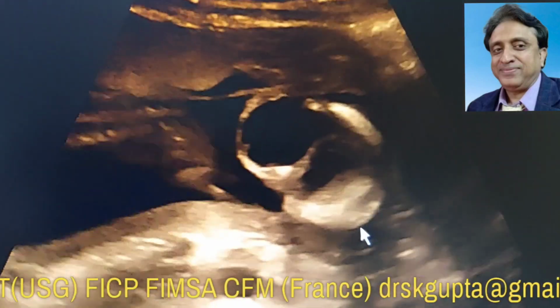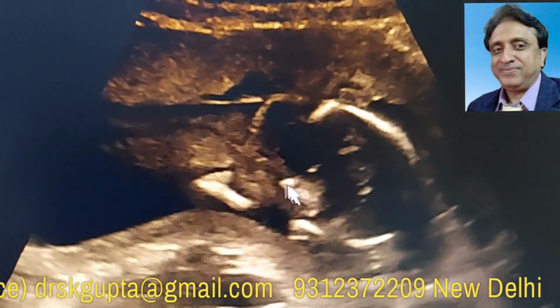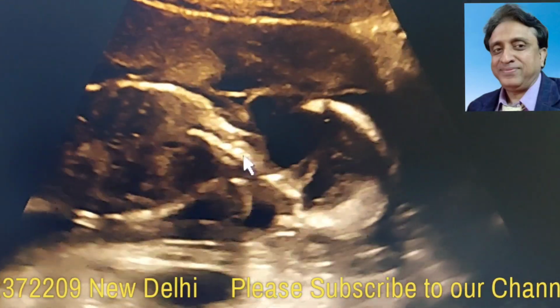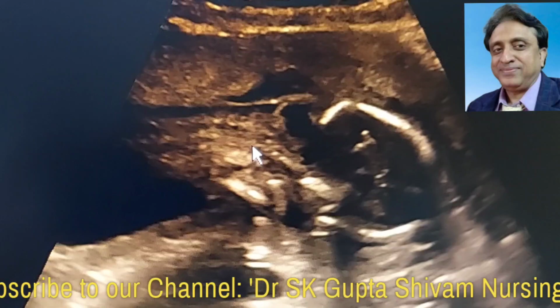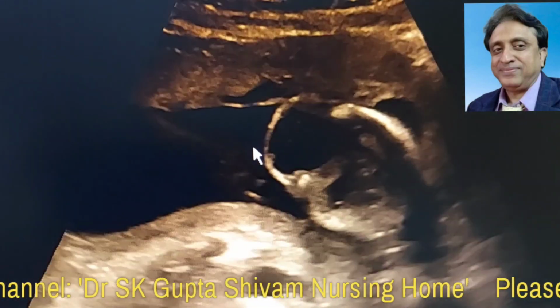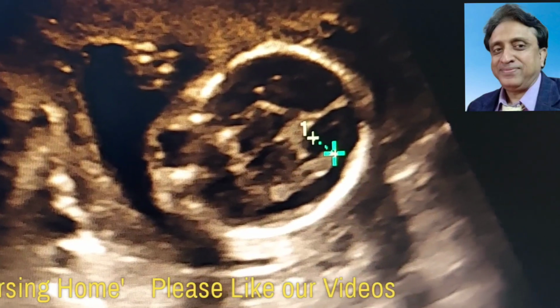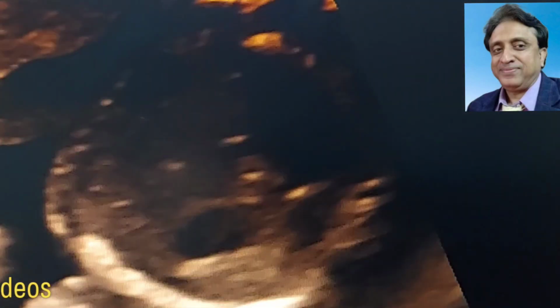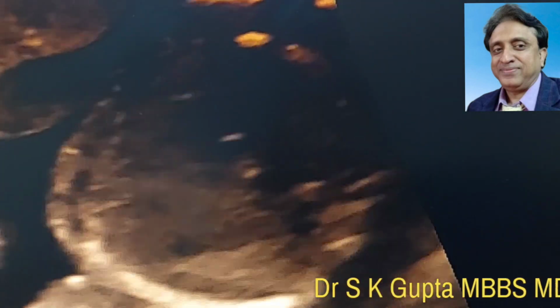To show you the cerebellar encephalocele in the sagittal section of the entire body, you can see that this is the cerebellar encephalocele which is hanging in the neck, and this is the spine. Fortunately, there was no spina bifida or the open spine defect in this patient. This is the lateral ventricle posterior horn, and it appears to be normal in size. This is the heart which is beating normally, and there were no associated congenital heart defects. The stomach bubble could be seen normally.